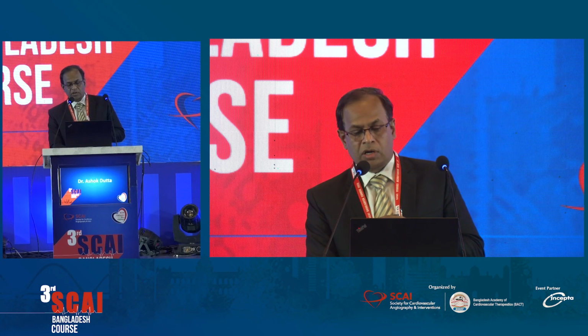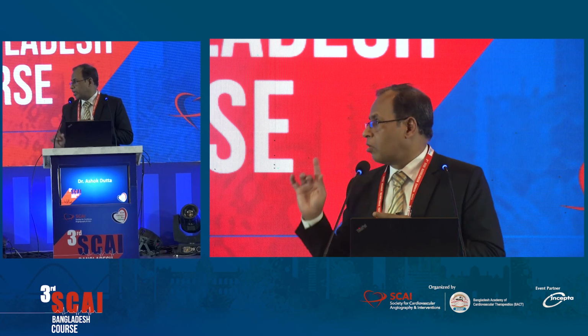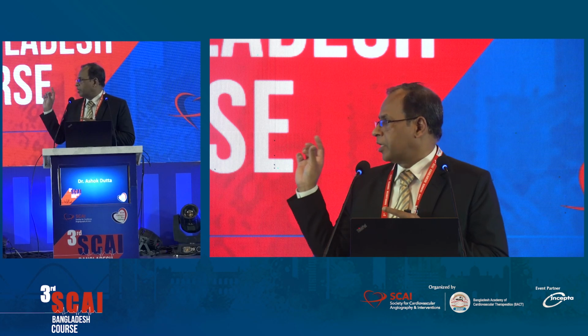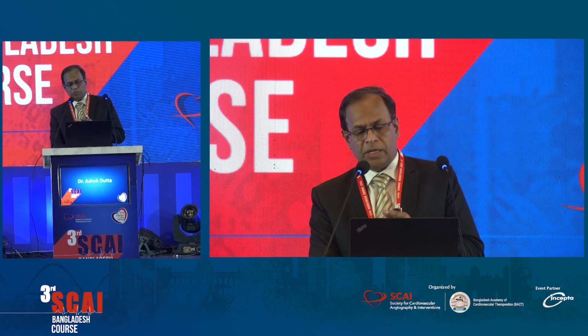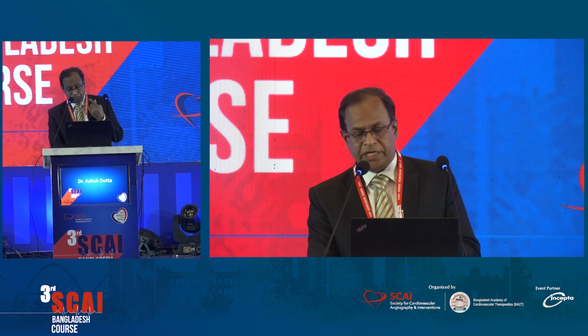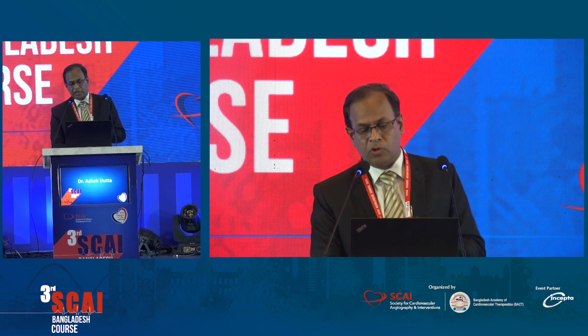This is proximally a 2 into 8 millimeter balloon that was inflated at one ATM. Even at 0 ATM, the balloon will be inflated a lot. It is not negative. Then I push it just proximal to the stent here. At the same time, the distal balloon that I used for post dilatation, I pull it back so that in a controlled way it can be moved up to the lesion, not distal to it.